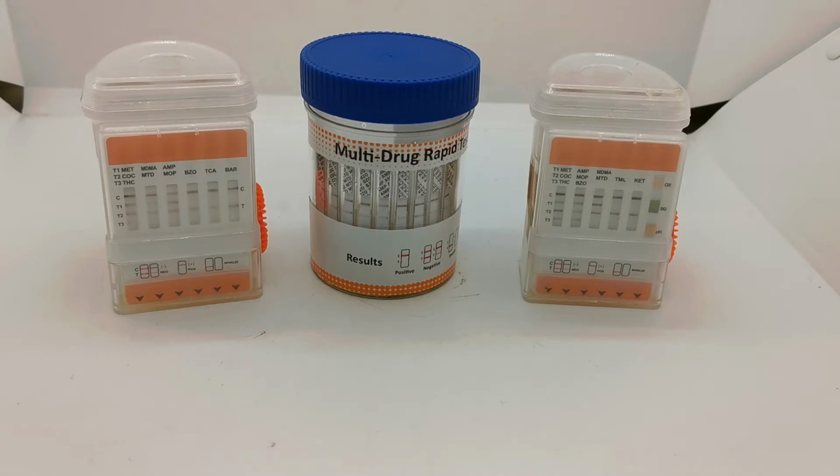In this video we are going to cover the subject of faint drug test results and what they indicate. In front of you is a selection of our best-selling drug test cups. These are multi-drug screening cups and are used widely in industry and workplace testing. The design varies slightly, but the tests are very similar.